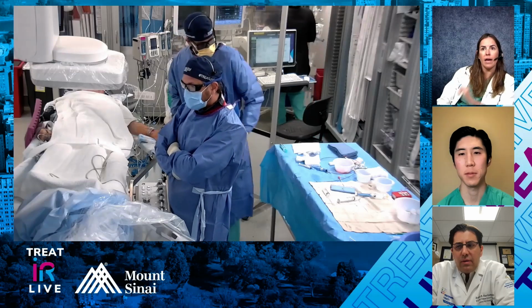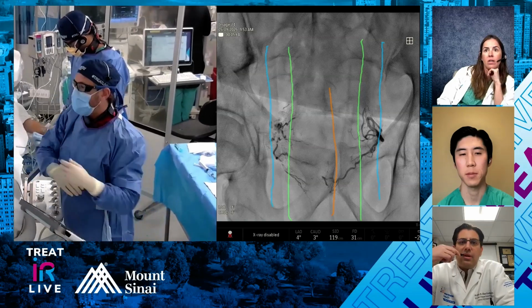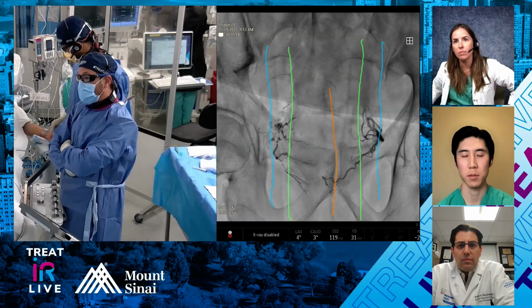We're almost at 10. Erin, I just wanted to comment a little bit about what now. What's your follow-up for this patient, both clinic-wise? What medications are you sending them home with, and what's the plan for the Foley? Yeah, so we mentioned somewhere between 2 and 4 weeks.